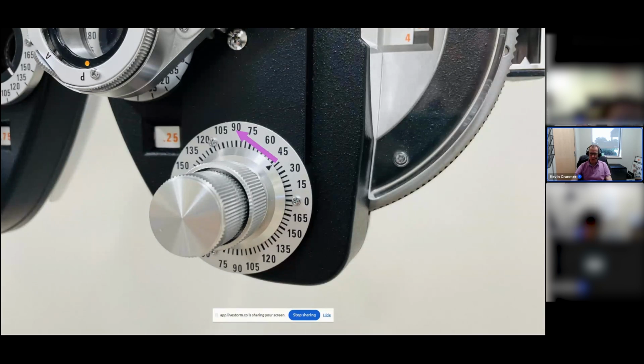But once you get it, then you can determine that axis even within a few degrees. I think going more than 5 degrees is sort of a waste of time. But you really can get it down to a very few degrees if you wanted to. But if you get them to within 5 degrees, then I think you're fine.